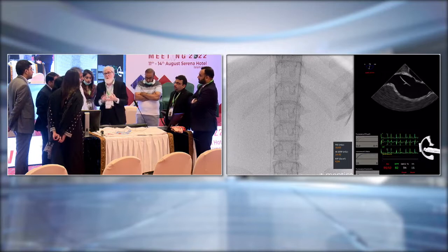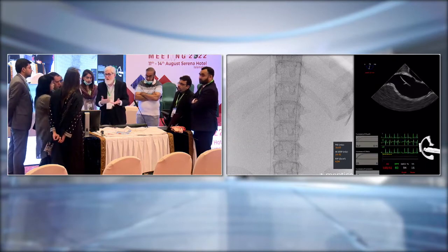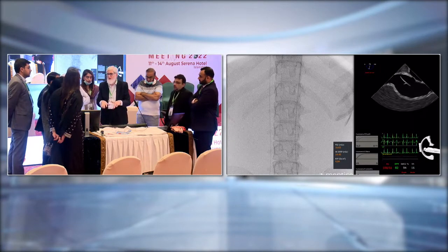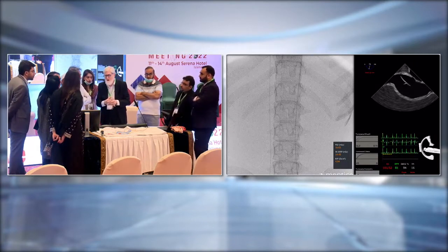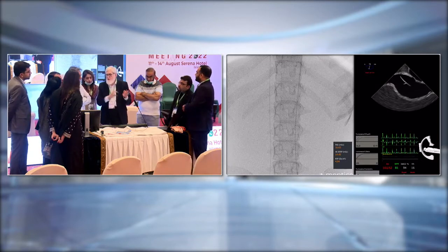And mind you, venous bleeds will not be evident on the table, and they will later be very difficult. If you close it percutaneously, again that is very difficult, because if there is a stagnant circulation, the clot can form very easily.